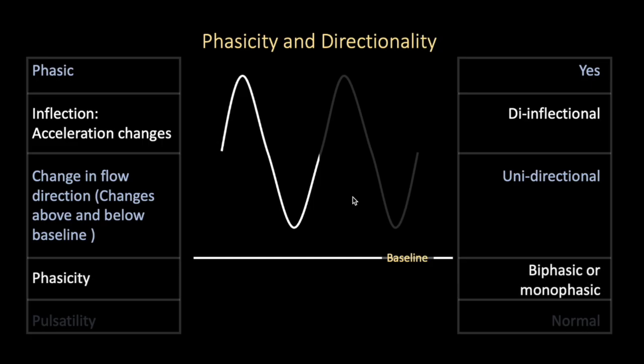The phasicity is a little bit more complex because sometimes this is referred to as biphasic or sometimes monophasic, depending on the definition of whether or not you're talking about does it change its direction of flow. So either one of those would be appropriate depending on the definition of phasicity.